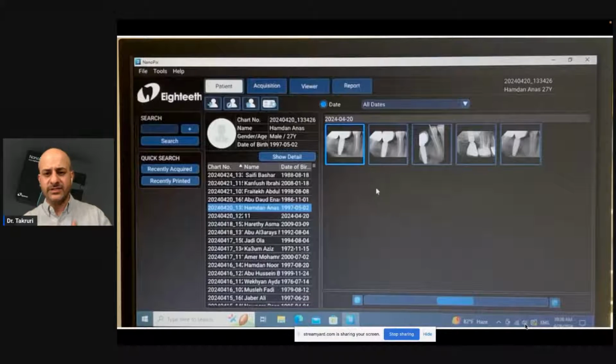I had one patient go out from my clinic and come back 2 days later with his sister, telling me to please use artificial intelligence on her teeth. So for them, Muhannad is treating patients with artificial intelligence. Because of that, your patient will be happy.